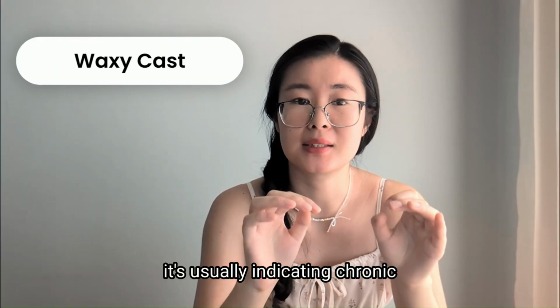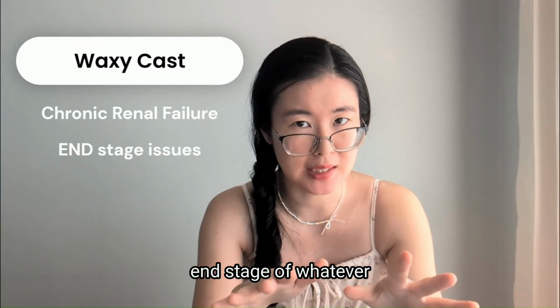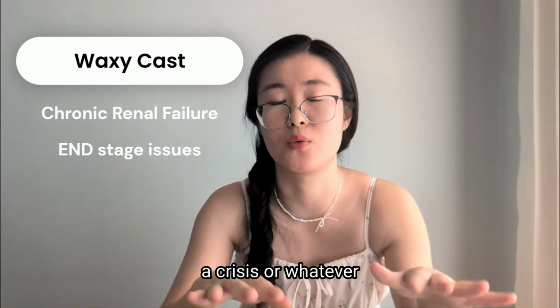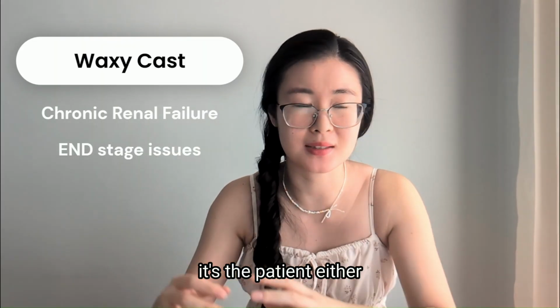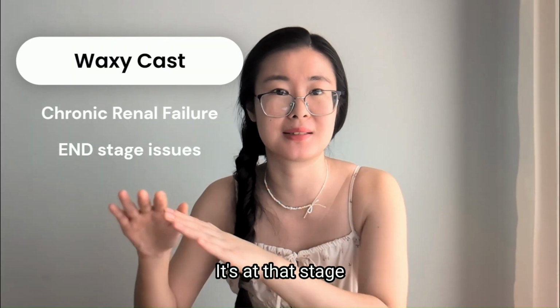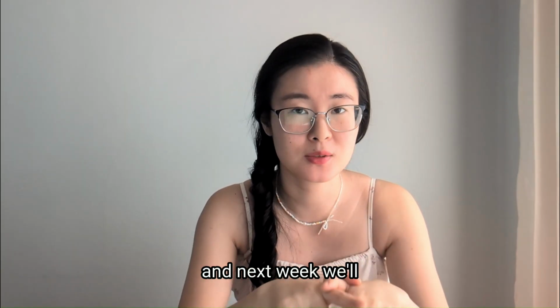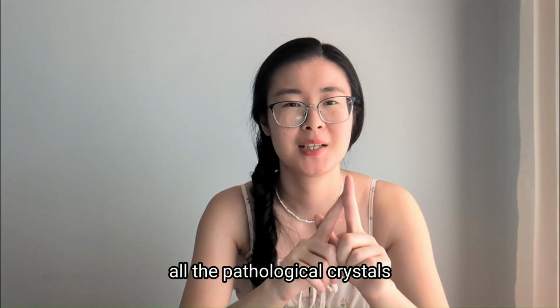Waxy cast is usually indicating chronic renal failure or end stage of whatever kidney issues. End stage, okay? Not anything like in the middle or having a crisis or whatever. It's the end stage. When you see this kind of cast, the waxy cast, the patient is either on dialysis or they need a new kidney. It's at that stage. So that basically covered all the pathological casts in your exam. And next week, we'll be finishing up with all the pathological crystals.